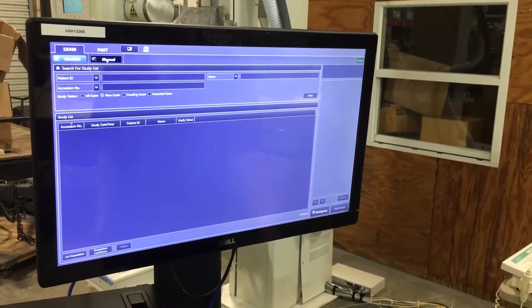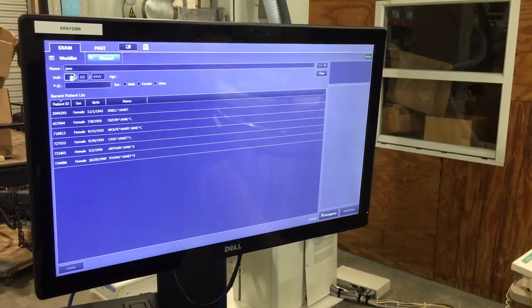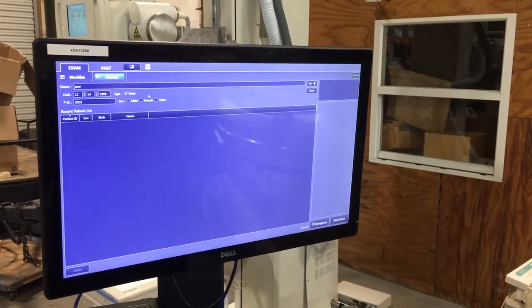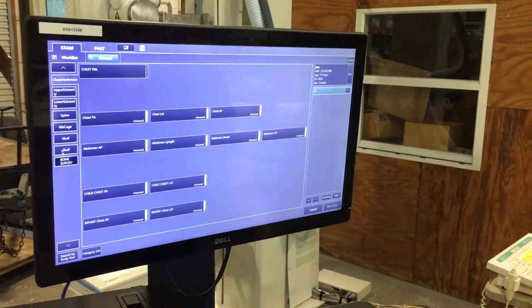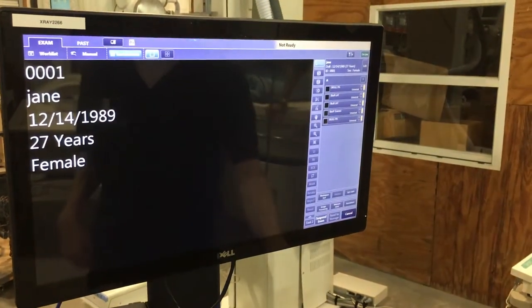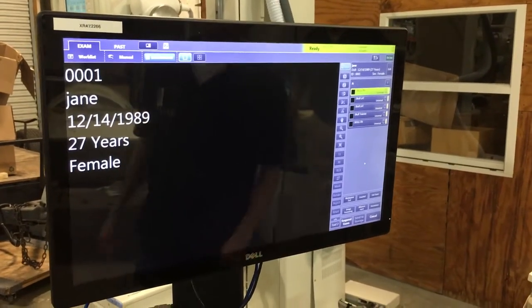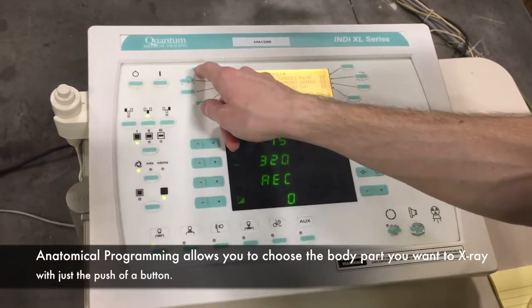When you put in a new patient you click manual, put in their name — Jane Doe — put in a random birthday, ID, female, and then hit set. We're going to demonstrate a skull x-ray. We're going to start the exam. The detector will let you know when it's ready when you see 'ready' in green. Now we move over to the control panel. The control panel is anatomically programmed — all you have to do is press the button and it will set the KVP and mAs to do the exposure you want.